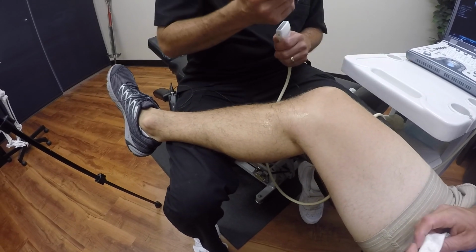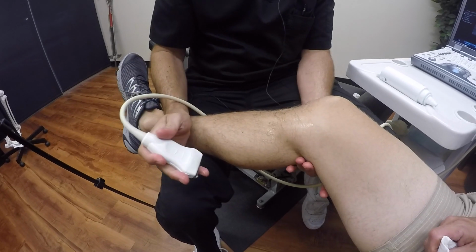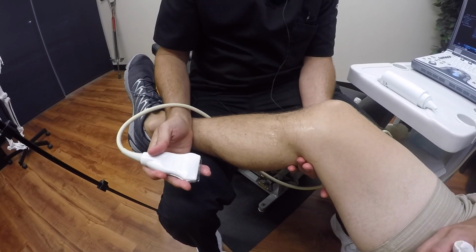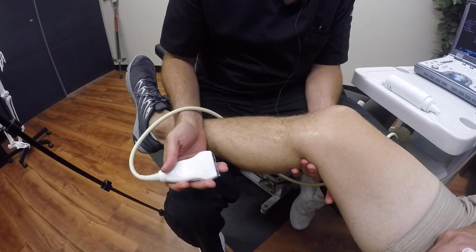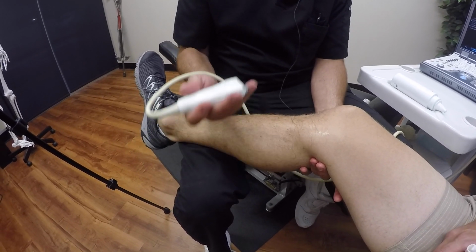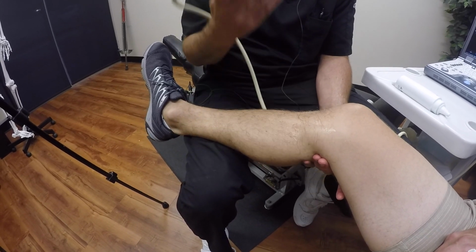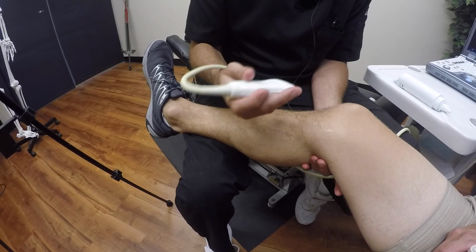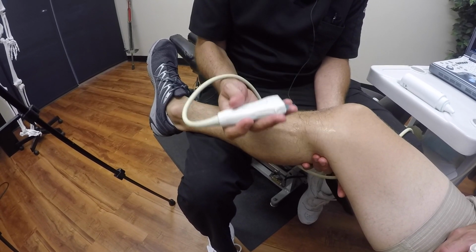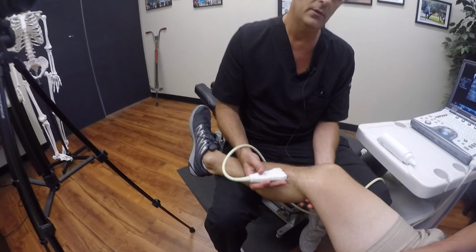So with something like that, usually people will try to get an MRI. Is this just as good as an MRI? I know we talked about it on the podcast a little bit. Yeah, each tool has its own advantage, and the MRI takes a very beautiful view of the knee. A layman, a person off the street, can look at an MRI and get a feel for where things are, whereas ultrasound takes a little bit more training to understand it, but each is valuable in its own way.